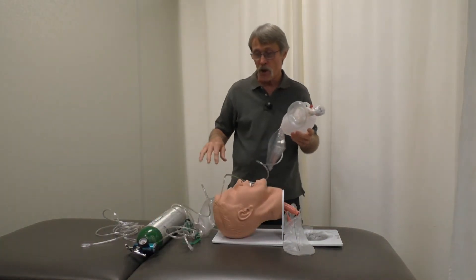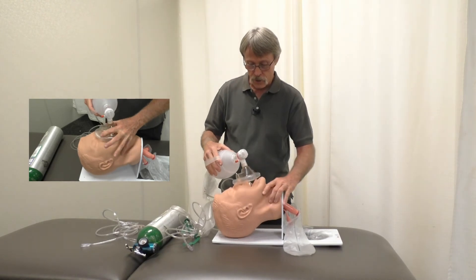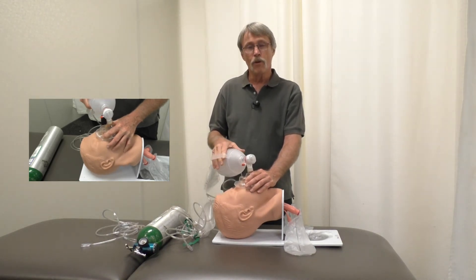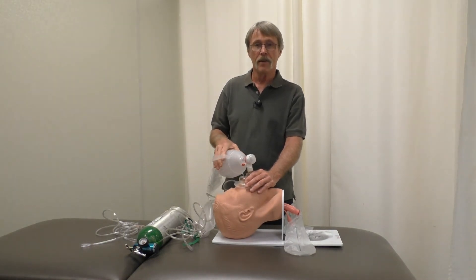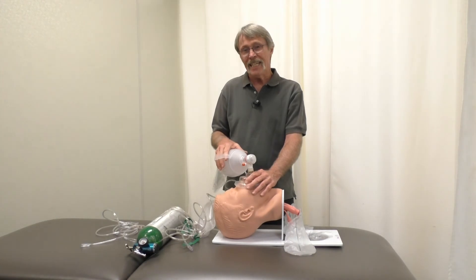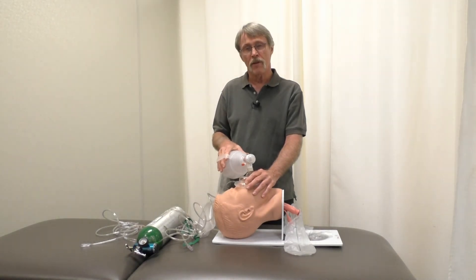This time you're going to go from anywhere from 15 to 25 liters. Now you're going to be breathing for them. Make sure you cover their nose and mouth and squeeze the bag to deliver a breath. My rule of thumb is: when I take a breath, I give them a breath. It's supposed to be anywhere from 12 to 18 breaths per minute — mostly 12, about one every five seconds.